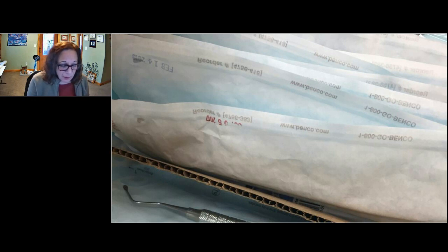First is the obvious. They dated everything on the paper side, which we just talked about. But also, the dividers are cardboard. This cannot be cleaned. Anything you're storing in healthcare should be in a container or bin that is cleanable, because periodically you should be taking everything out of that container, even if it's sterile instruments, cleaning that bin to make sure there's no dust or debris accumulating in there, and then once it's dry, putting the instruments back in. You can't do that with the cardboard dividers.